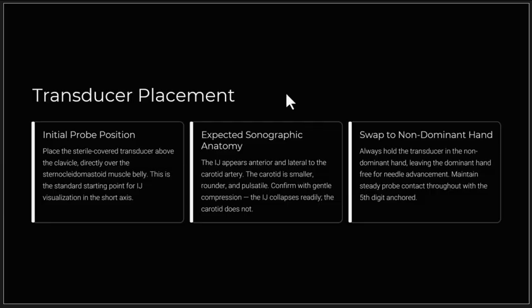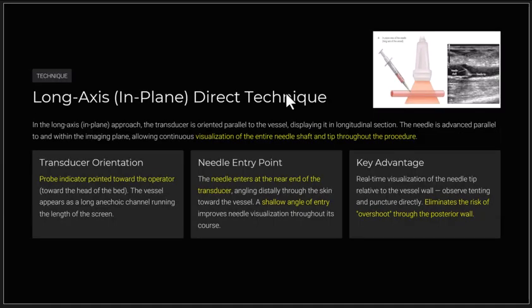Now, there are a couple different ways to perform the procedure, something called an in-plane and an out-of-plane technique, and we're going to cover those next. The in-plane technique is actually used less commonly than the short axis or out-of-plane technique, but let's just start here with the in-plane technique.